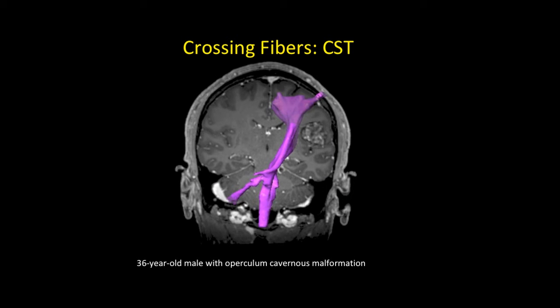Here's another case of a cavernoma in the left frontal operculum where the fibers to the face are omitted. It's a good idea to anticipate where the missing fibers could be and add this to our reports. Just because we don't see the intact fibers on DTI doesn't mean that they aren't there.